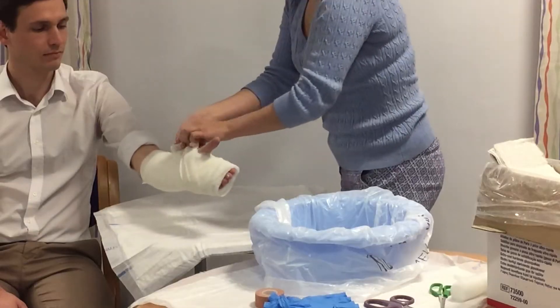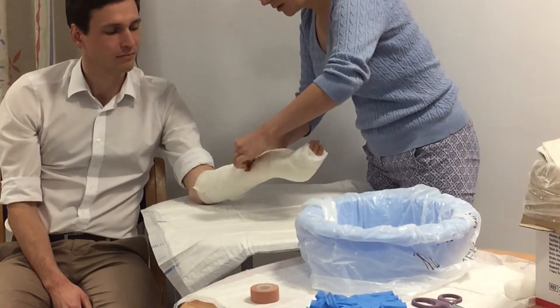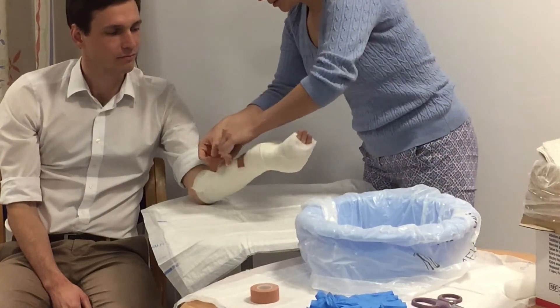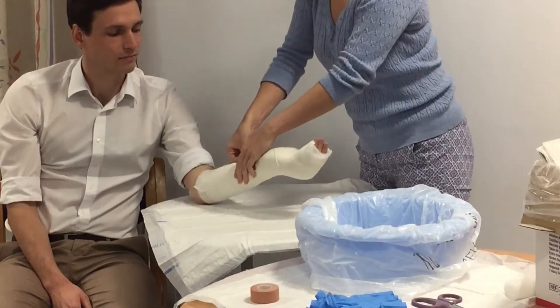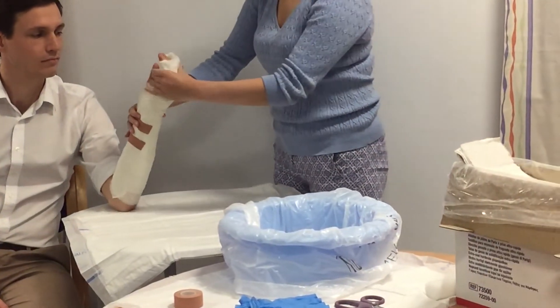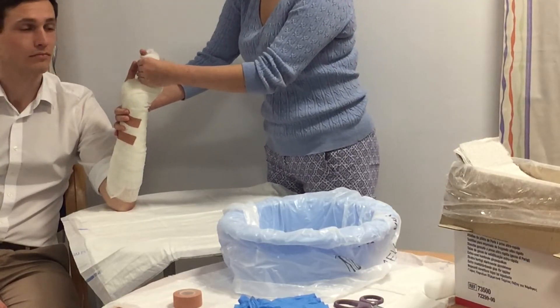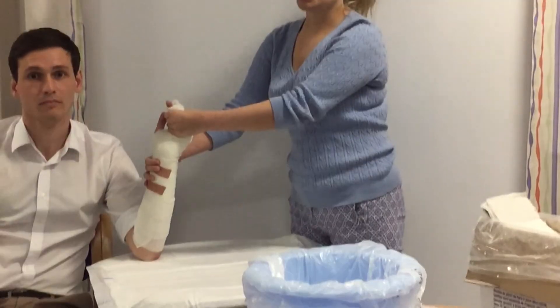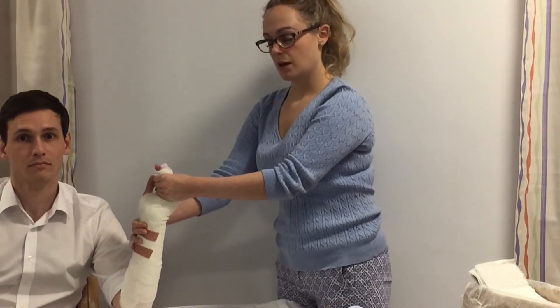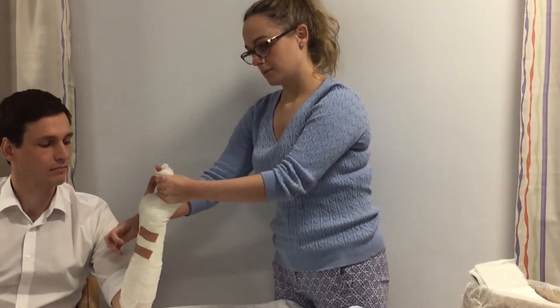Then we tape it down — here's one prepared earlier. We tape the end and then want to put it in the position of safety: hyperextend at the wrist to about 30 degrees, and flex at the metacarpophalangeal joints to 90 degrees, with the fingers remaining straight. You need to hold in this position until it hardens.